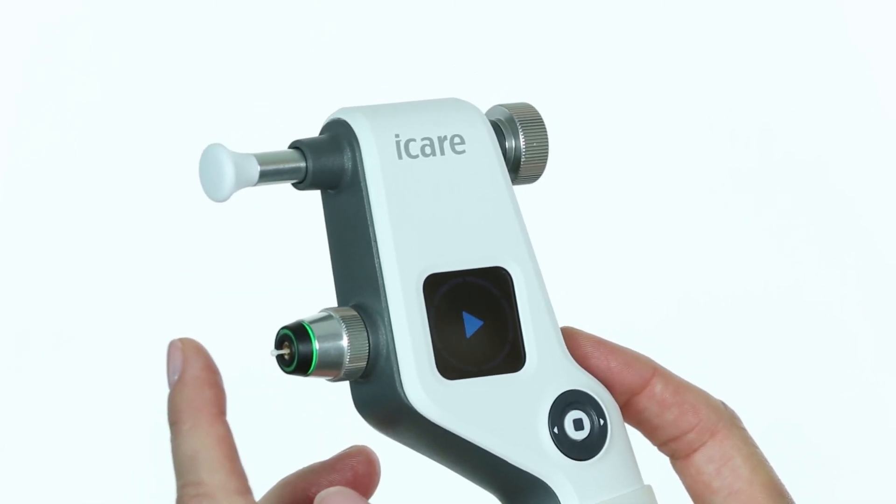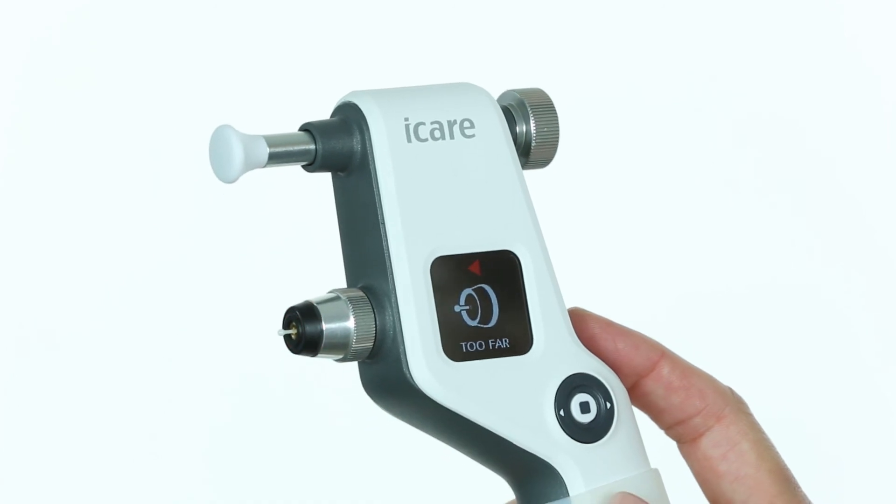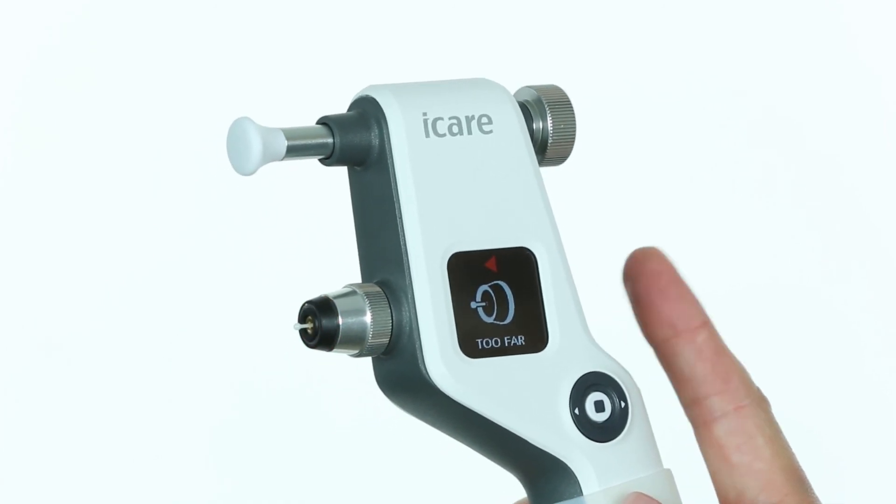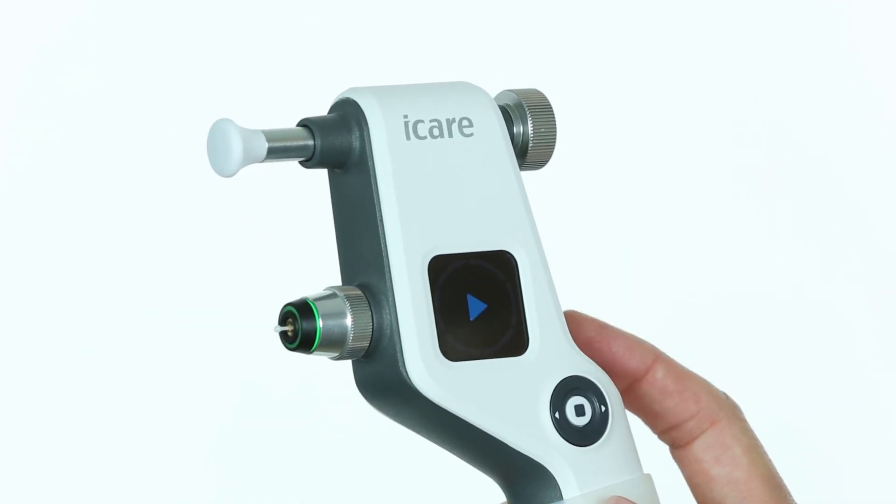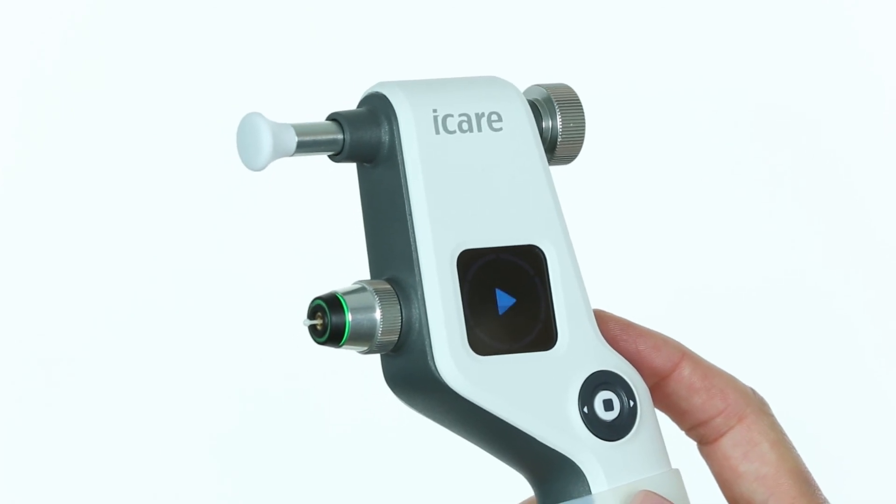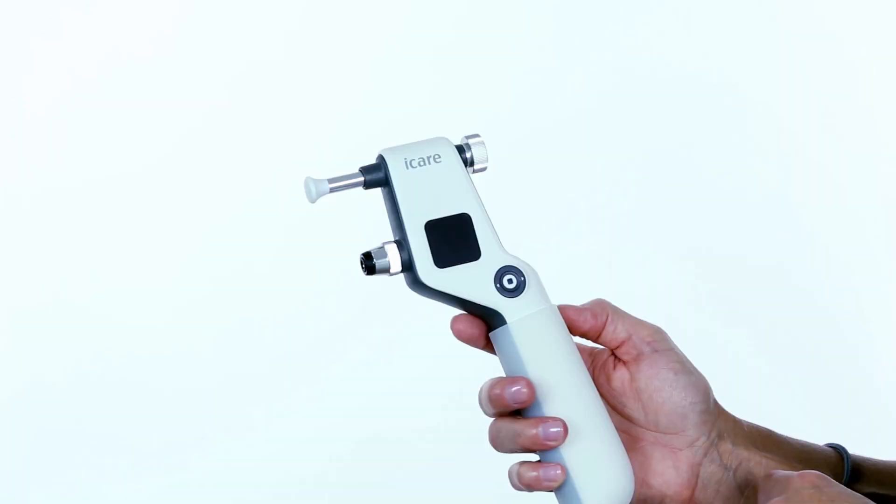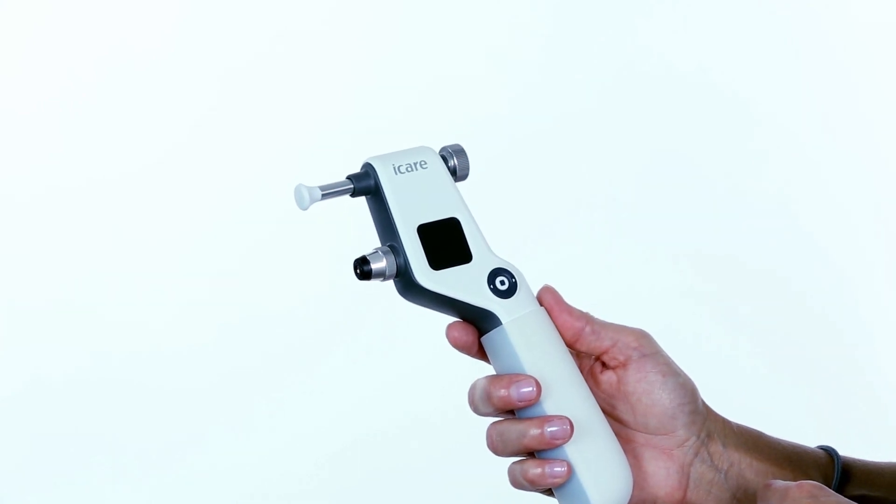If you are too far from the cornea, then too far will show in the display and the probe base light flashes red. Clear the error message, correct alignment, and continue measurement. If the tonometer is not used for 3 minutes, it will turn off automatically.